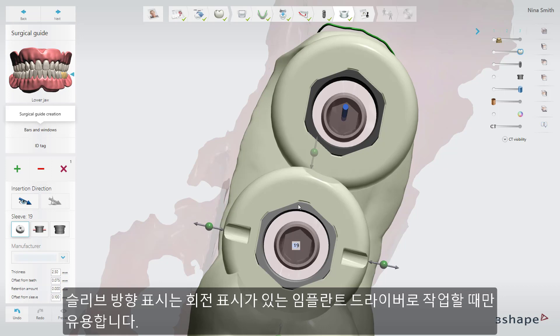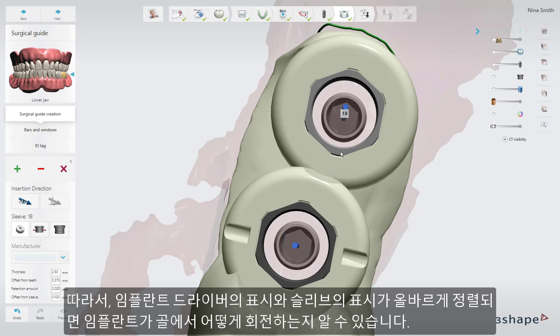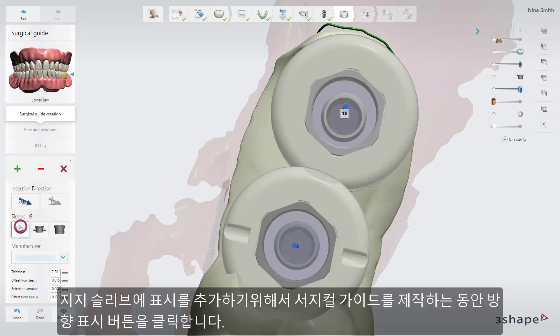Sleeve orientation marks are only useful when you also work with implant drivers with rotation marks. When the mark on the implant driver and the mark on the sleeve are aligned, you will know how the implant is rotated in the bone. To add the marks on the support sleeves, click the orientation marks button while creating the surgical guide.